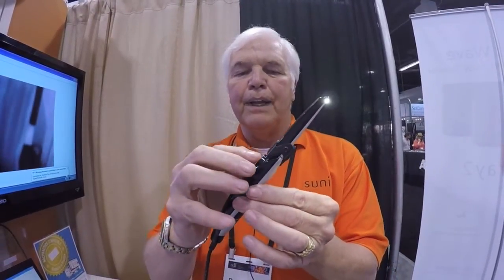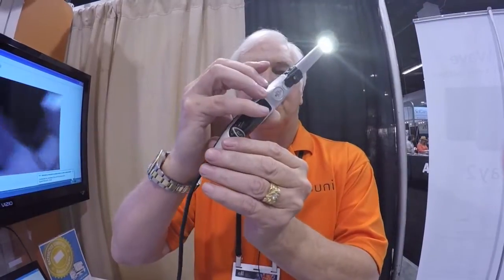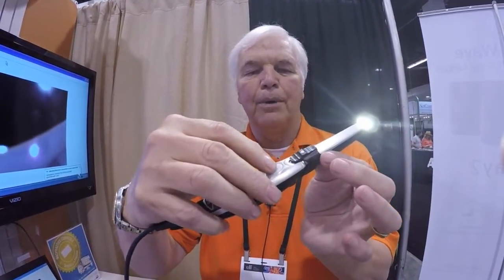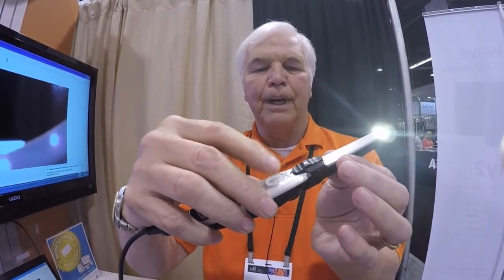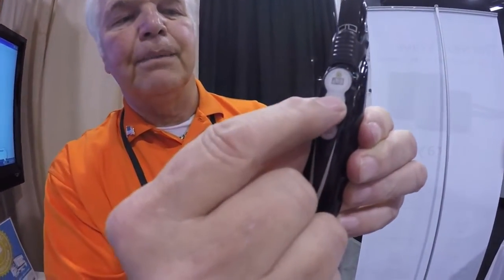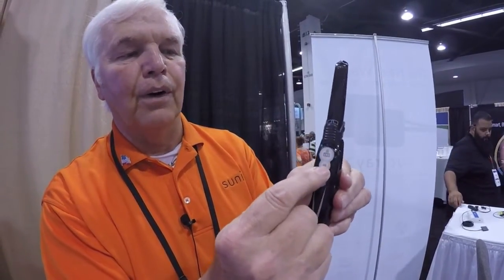You also have a button here for capturing when you're doing the lowers, or if you're doing the uppers, you have a capture button here. There's also a little rubber nipple here that picks up your fingerprints. So if you got gloves on, you can pick it up and then you hit and capture the image. Coming around the back side, you'll see the light intensity button underneath the capture. That's where I was hitting it to adjust the light and turning it off.